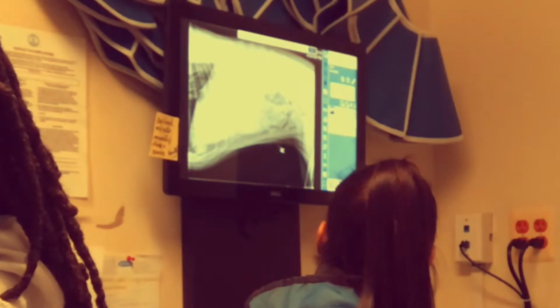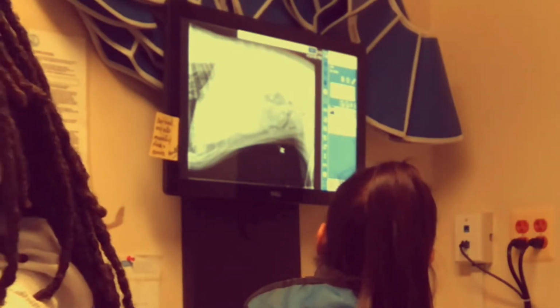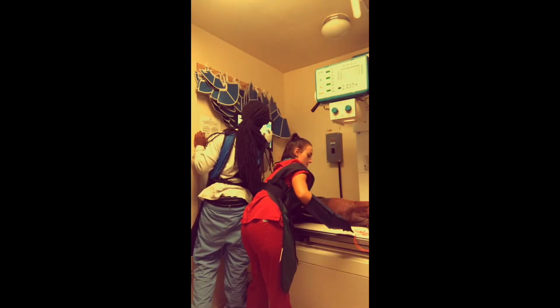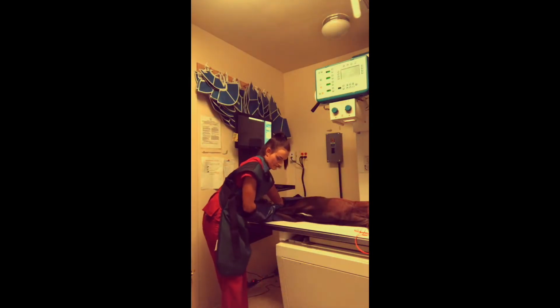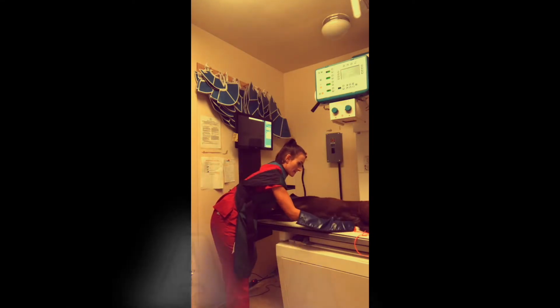Normally, the liver is beneath the ribs, but the position is affected by the patient's breathing and the type of the species. The margins of the liver are best visualized on a lateral radiographic view. The cranial margin of the liver nearly parallels the borders of the diaphragm and is easy to see. However, the caudal portion is typically hard to see on the VD view.